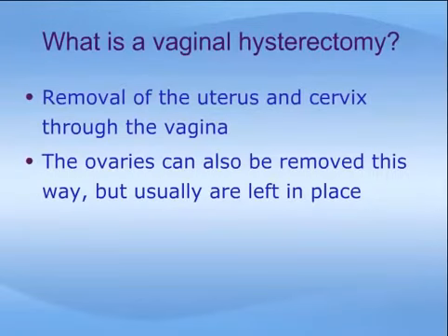Hysterectomy means removal of the uterus. Vaginal hysterectomy simply means that the hysterectomy is performed through the vagina. In almost all cases, the cervix is removed along with the body of the uterus.